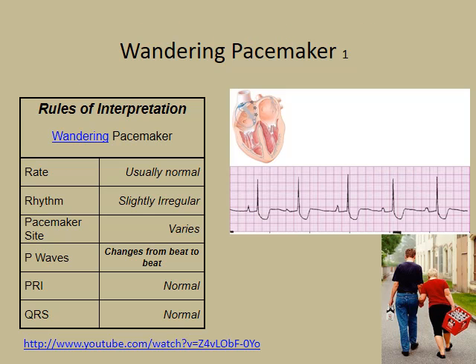All right, remember your chart that we built in the sinus family. Develop that same chart. Get your 5-step rhythm recognition and place those 5 steps on the left side of your axis and your names of your atrial rhythms across the top.